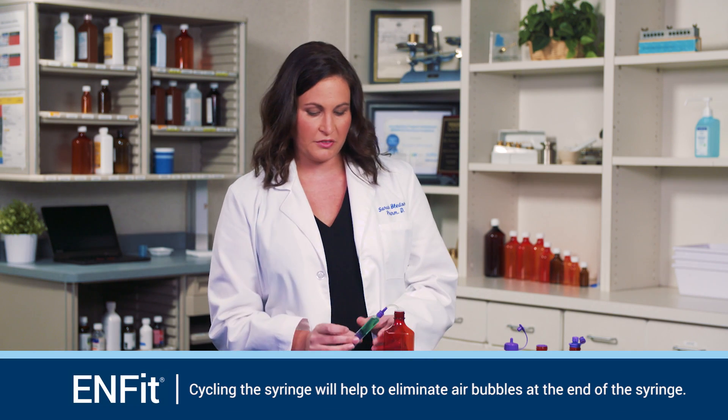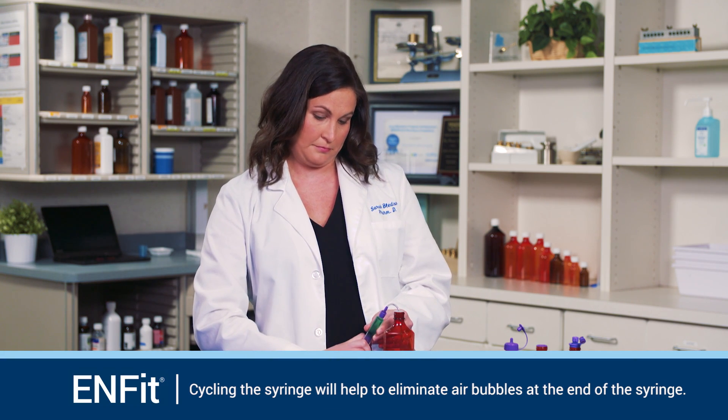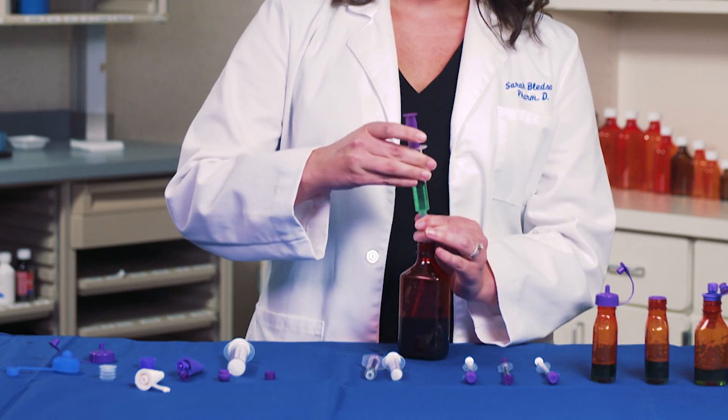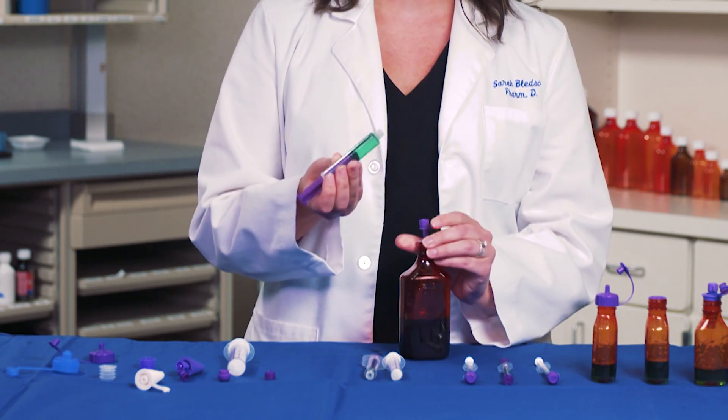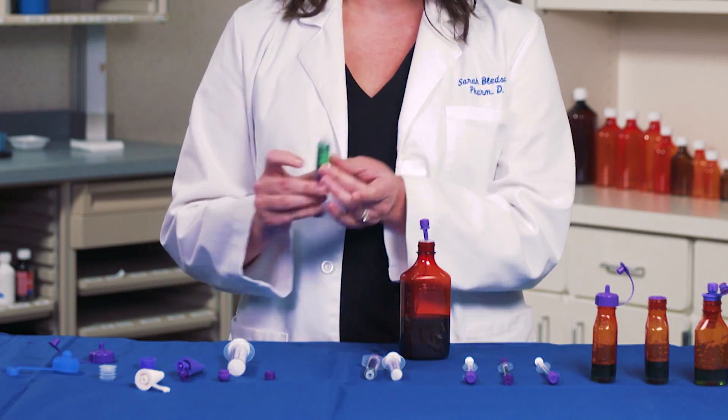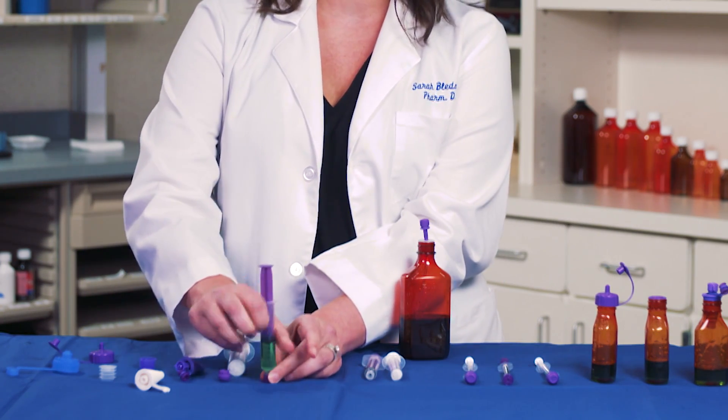You may need to work with the syringe to remove any air bubbles. Once you have achieved your desired volume, unscrew the syringe from the medication straw, double check the volume and the tip of the syringe, and then apply the NFIT cap.